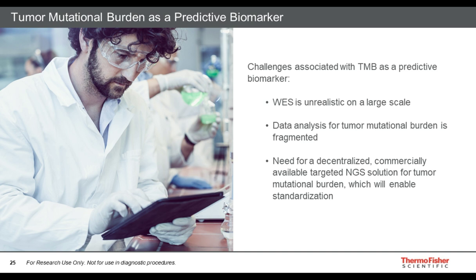Targeted panels are typically preferred in clinical settings. There's also, in the early approaches based on whole exome, a need to determine which variants are somatic variants by also doing whole exome sequencing of a matched normal sample, so that germline variants can be identified in the normal sample and removed to reveal which of the variants are somatic. But logistically, that's often very hard to put into practice, and so a tumor-only approach is also preferred.